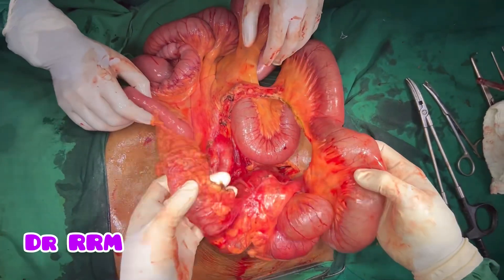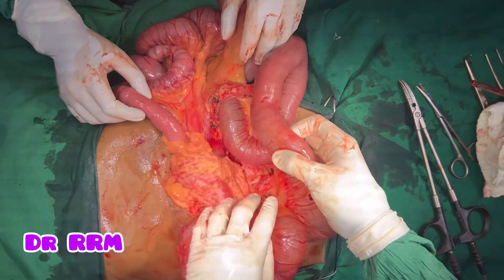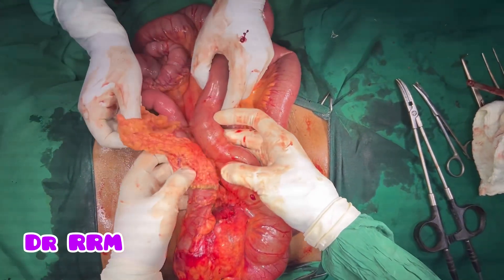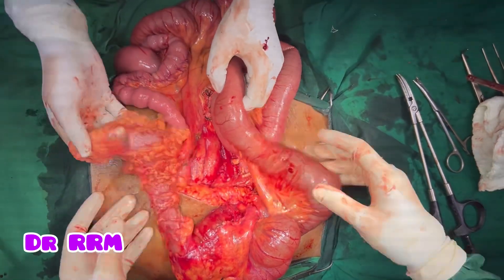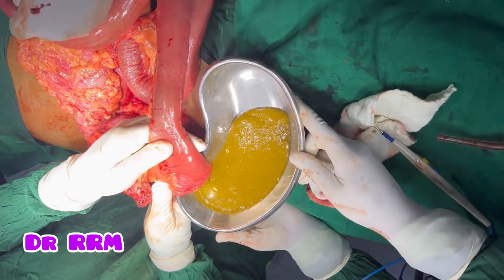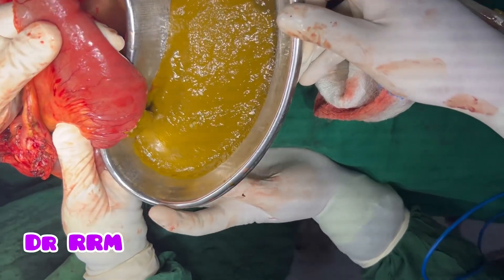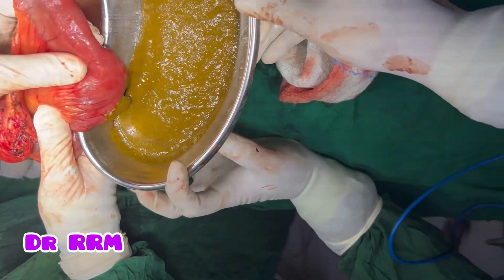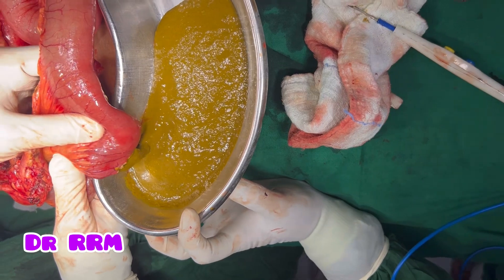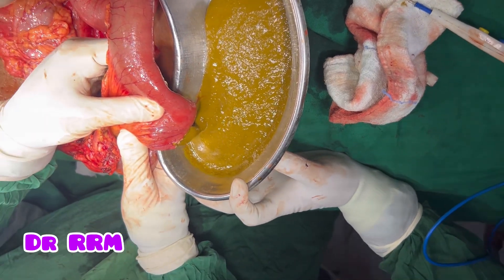We are going to do resection of this segment and perform an ileocolic anastomosis. Because of the obstruction, the bowel is fully loaded with stool, so we are removing the contents.